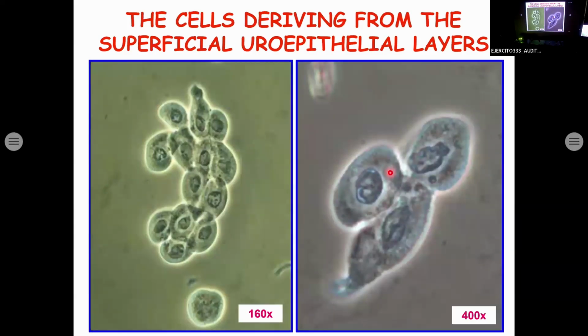It is important to know that superficial cells are commonly found in urine. For instance, if you have a patient with cystitis, the superficial cells are frequent. But when you find deep transitional cells, especially in high number, more than one per high power field, it is very probable that the patient has a urological disorder, okay?